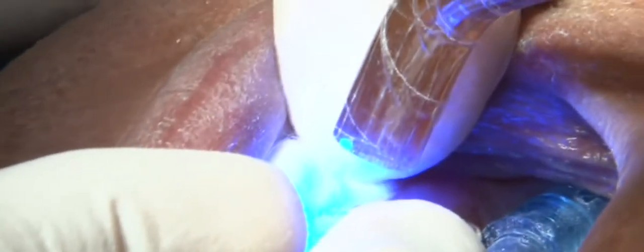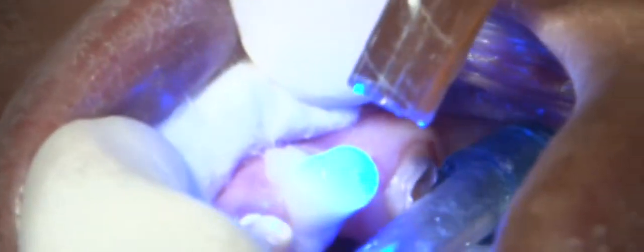Once this is done, now we will build up the core using the preformed cellulose cap. The Luxa Core Smart Mix is injected in the core former. Care should be taken to not let the intraoral tip of the syringe become embedded in the material as it flows out. Once the core is filled, it is adapted on the post-covering tooth and cured for 20 seconds with a PAC light. I am not concerned about fully curing the material since it is dual cured and will set by itself.